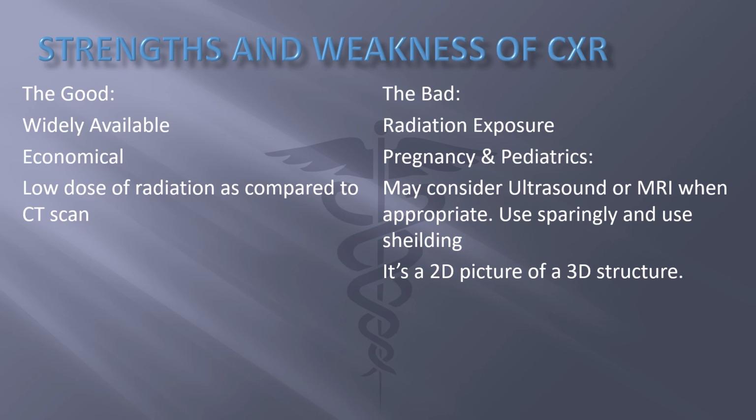So it's widely available. It's economic. It's not that expensive. It's actually low dose radiation as compared to CAT scans, because CAT scans are taking many images all at once, where X-ray is just a single exposure for one image. So that's some of the strength of the chest X-ray.